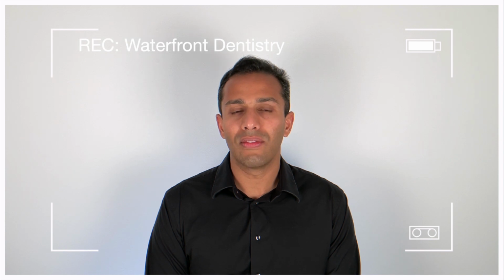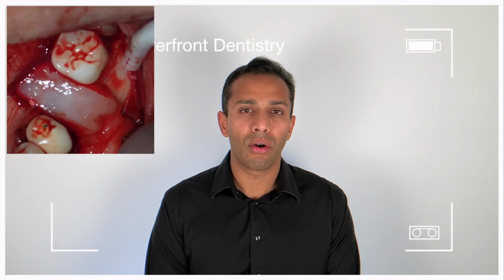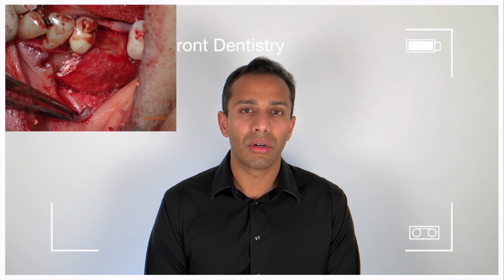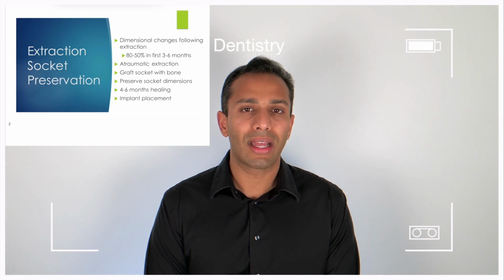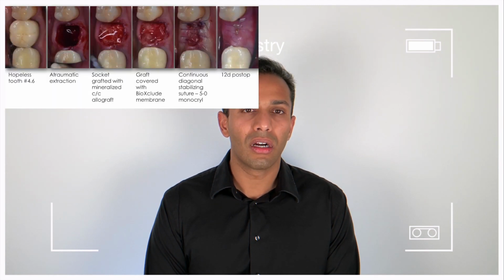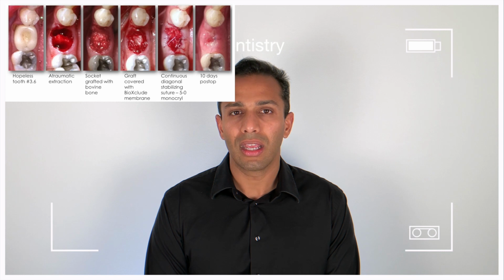In certain cases, we even use intermaxillary or interbony fixation screws and certain kinds of bone morphogenetic protein liquids with collagen filaments or fibers to help the body accelerate healing and have the graft and the host take. So these are all fairly extensive, invasive, and expensive procedures, and this is why we would rather you think about having implants placed either at the time of extraction or within a year if we do bone grafting or ridge grafting in the immediate extraction period.